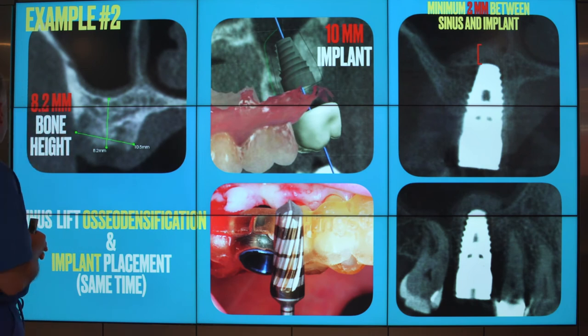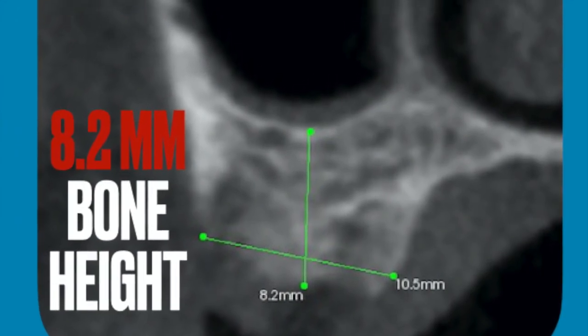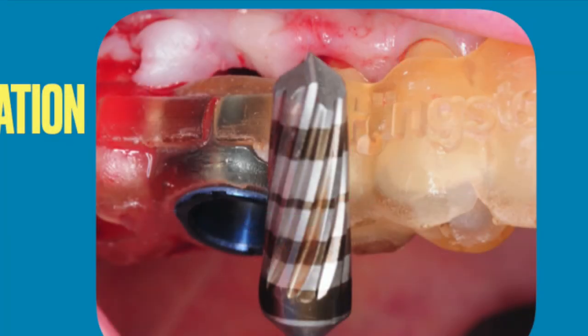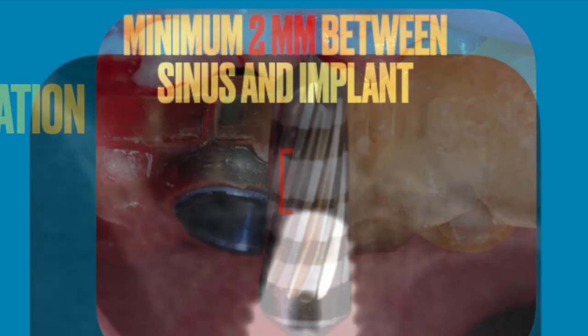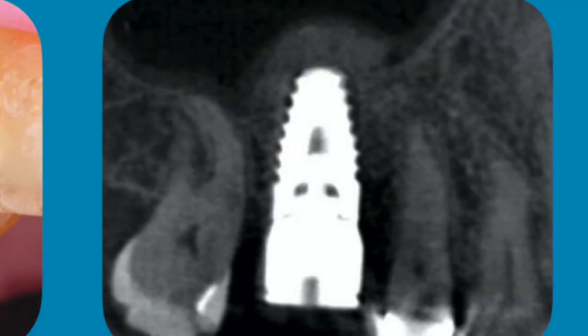The second patient, here's a patient that has about 8.2 millimeters of height of bone. And through our digital diagnostics, again, we'd like to place a 10 millimeter implant, and using the osteodensification technique, we go ahead and raise the sinus, do the bone graft, place the implant at the same time, again, with the same result of great bone augmentation and the adequate separation between the two, while we're maximizing our diameter and length of the implant for long-term support.